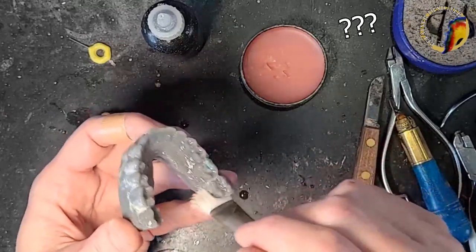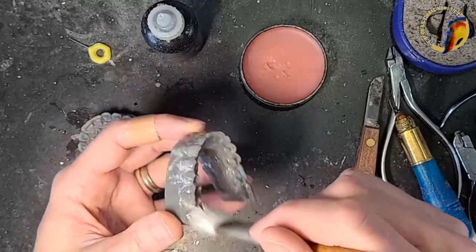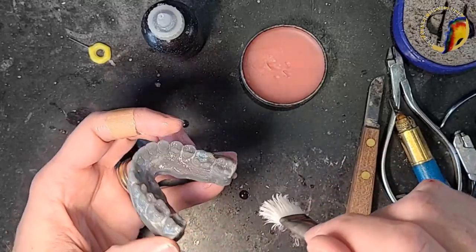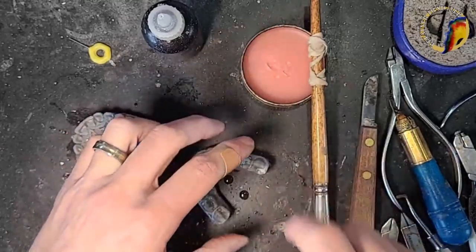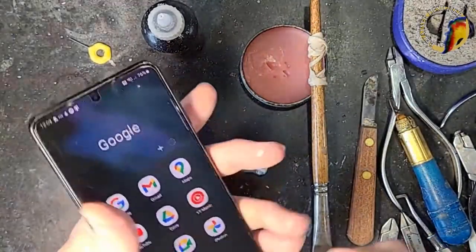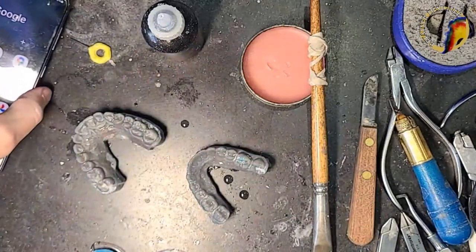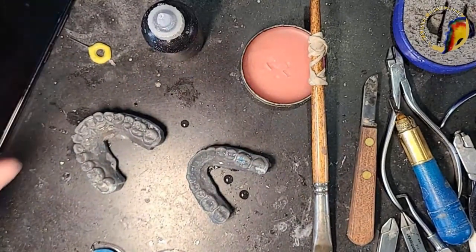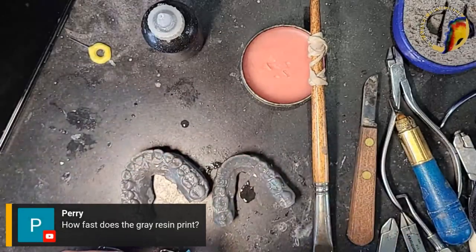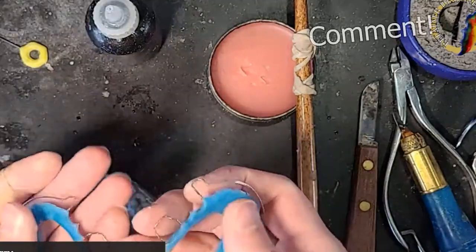Oh, it burns your fingers — that's super hot! I'm going to set it here and let it cool. We'll put it in the window when it cools down. All right, so I've got these painted, so let's go.